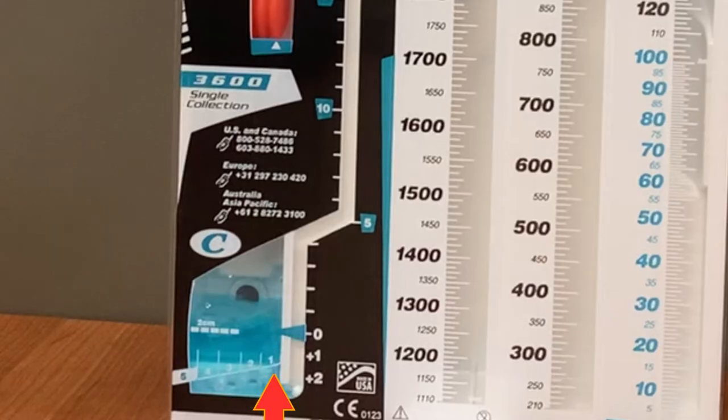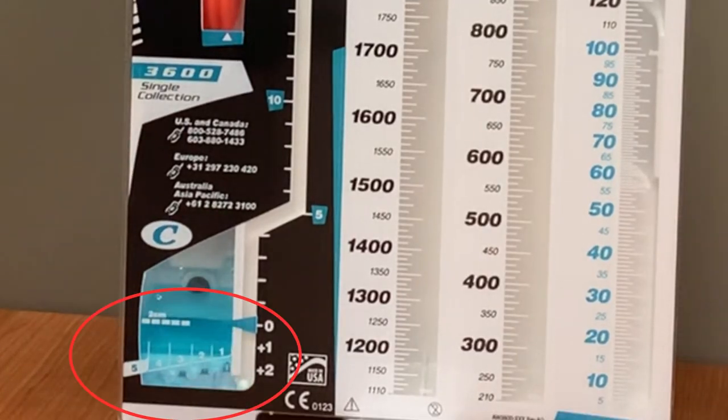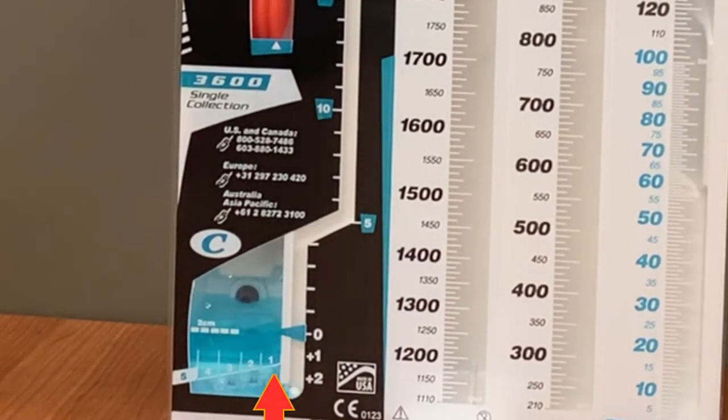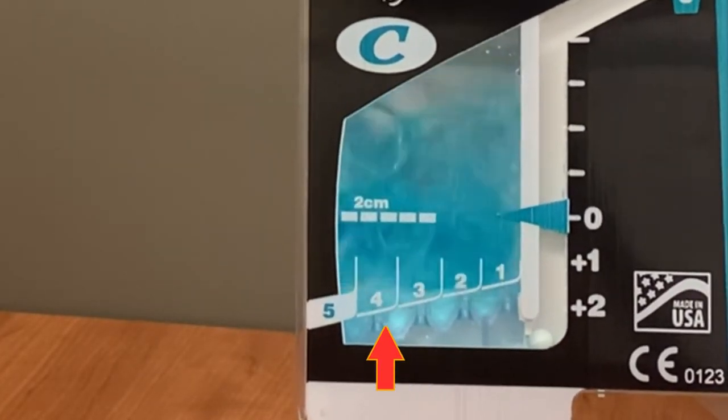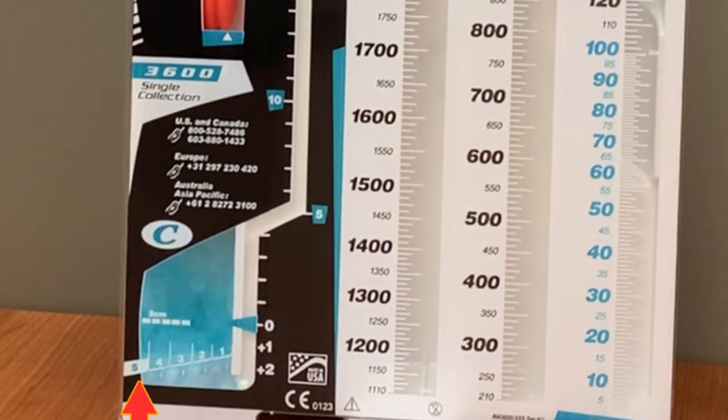There are markings on the chamber to help identify the severity of bubbling. A small air leak will produce bubbles that don't extend far from the right side of the chamber. There is a numeric scale labeled one through five. If the bubbles only reach the one marking, that is a small air leak. If the bubbles extend further, the leak is bigger. If they reach all the way to the five, that's considered a large air leak.